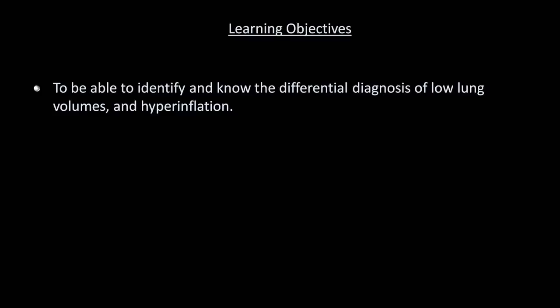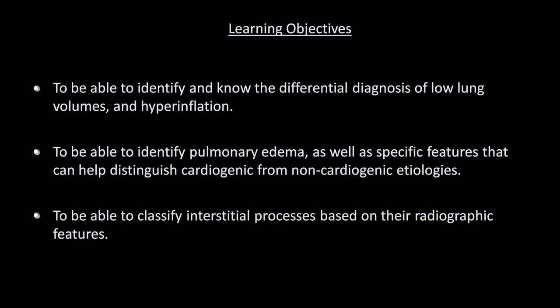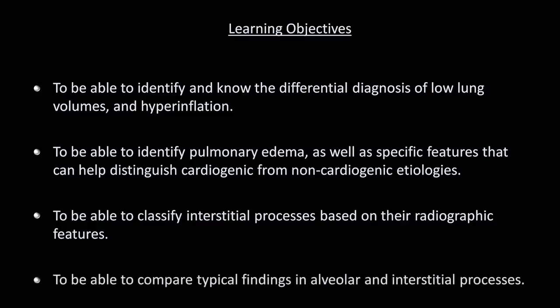hyperinflation. Second, to be able to identify pulmonary edema as well as specific features that can help distinguish cardiogenic from non-cardiogenic etiologies. Third, to be able to classify interstitial processes based on their radiographic features. And finally, to be able to compare typical findings in alveolar and interstitial processes.